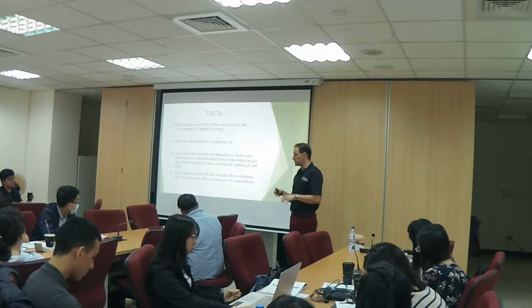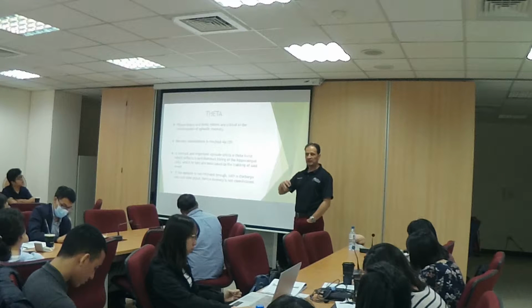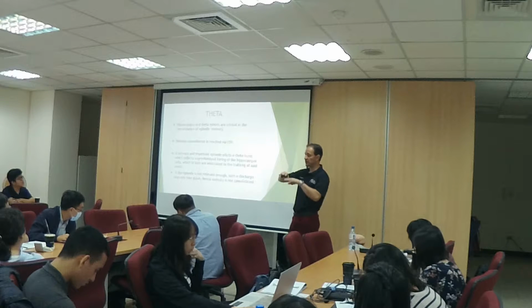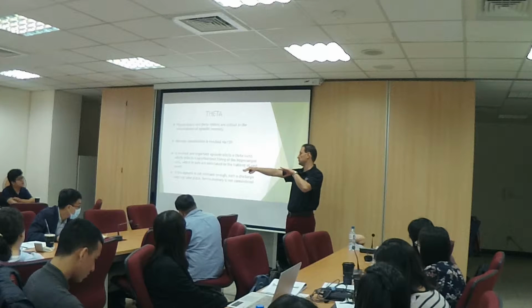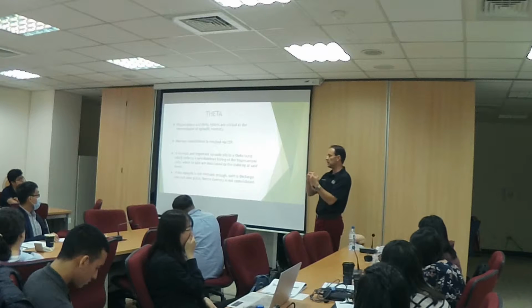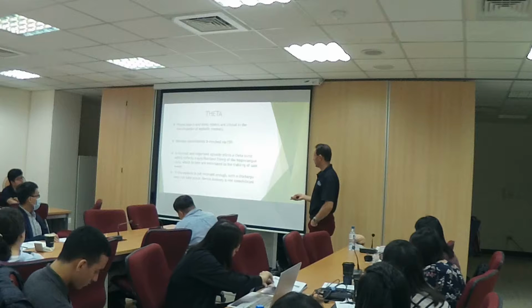And you can see on the EEG when a person's brain is not consolidating that very well, you can see that the activity starts to desynchronise, so the channel looks flat. So there's not a lot of firing going on in the neurons in those networks. And you can tell that something is going on there. So the neurons are not communicating and they're not sending the message where it needs to be sent. Okay.